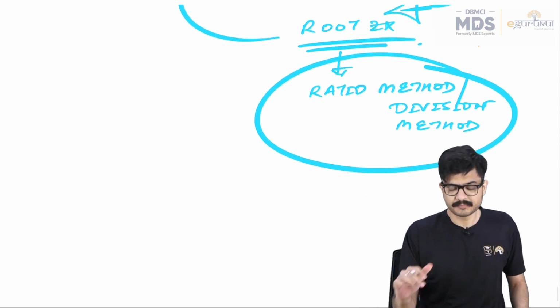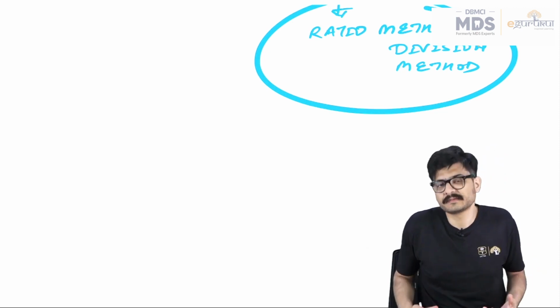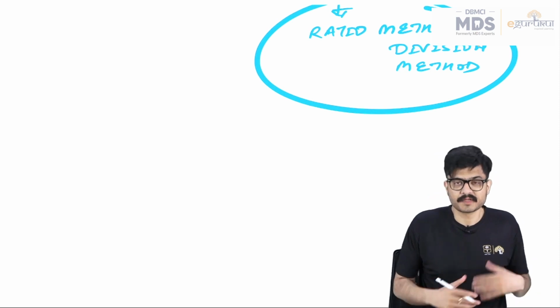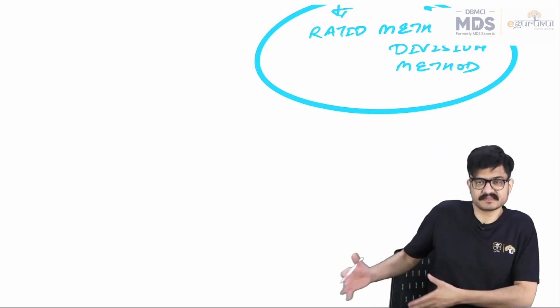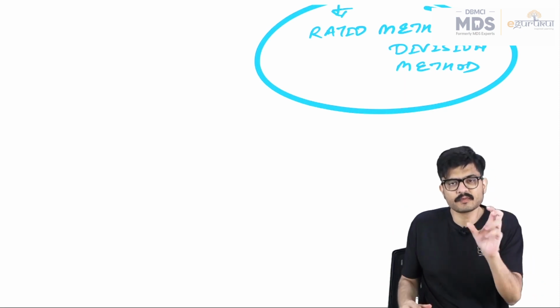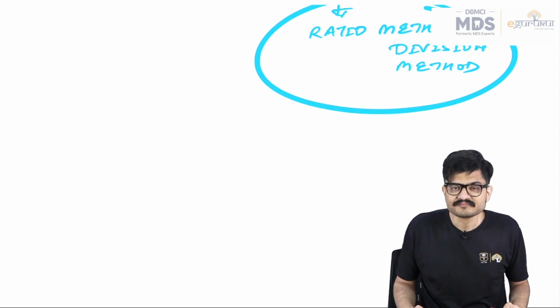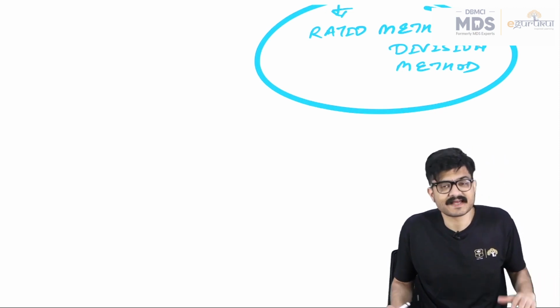And next important point, it is relatively unaffected by the presence of fluids inside the canal. Again, because whatever difference in the capacitance values of the numerator and denominator that fluid would be making would be cancelled out in the numerator and denominator, isn't it? So therefore, if the canal is dry, then also it's giving you a nice accurate value.